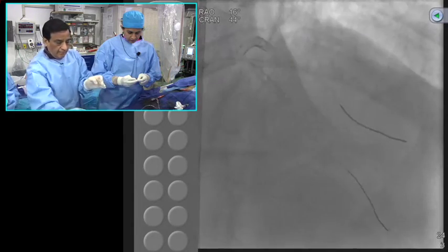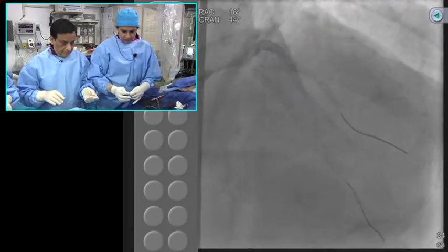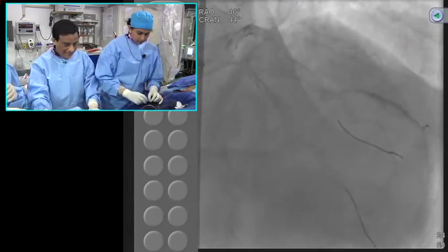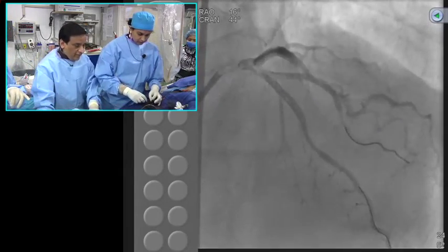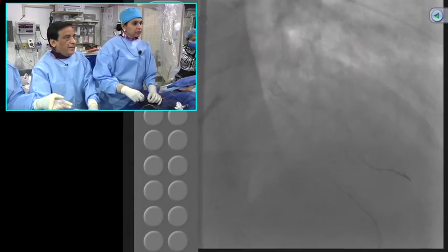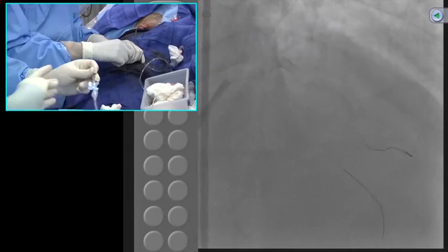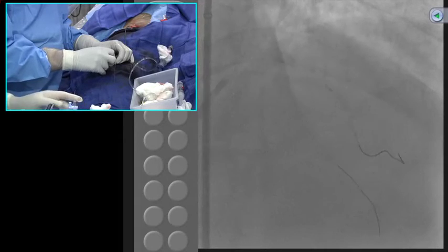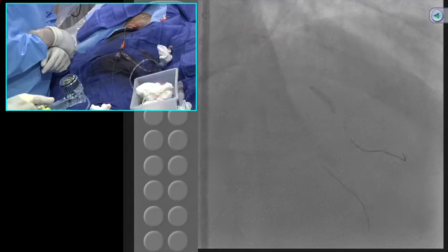EKG is fine. I am also told you had an exceptional and ultra brief TAVI case last week. Yes, so this was our structural webcast. It was very, very good. And Evolut R is the addition to our CoreValve family. Super valve does not move and it stays. Although it's hailed as recapturable, in none of the cases did we need to recapture because wherever you start, it stays there.